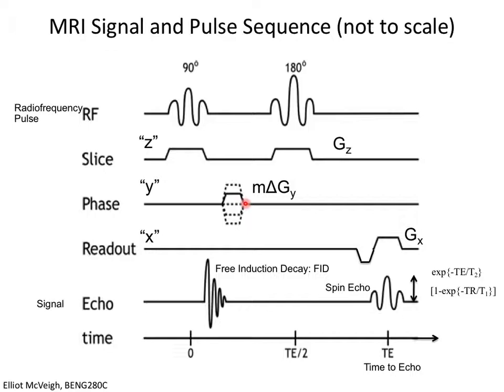Over time, the magnetization vectors as a function of Y during this gradient will evolve to produce a phase angle shift dependent on Y. If I look down a column as Y is changing, the magnetization vectors will have essentially a helical distribution, because the amount they've precessed over time is different. So I do that once, and I produce that phase shift as a function of Y.